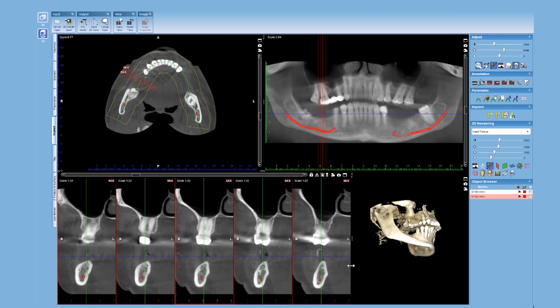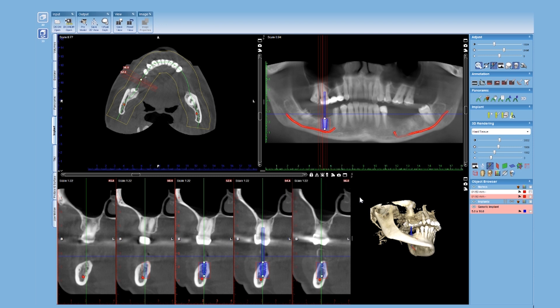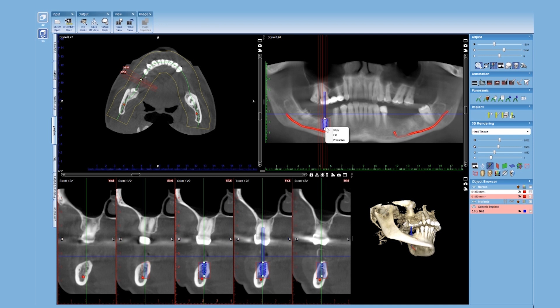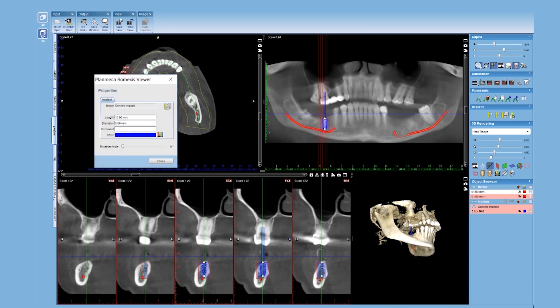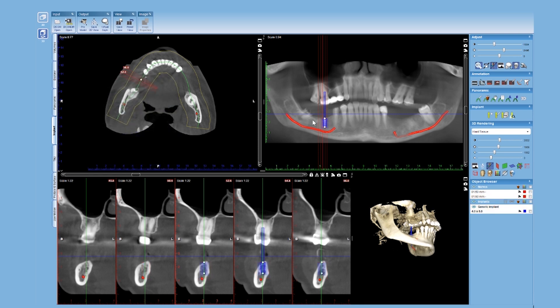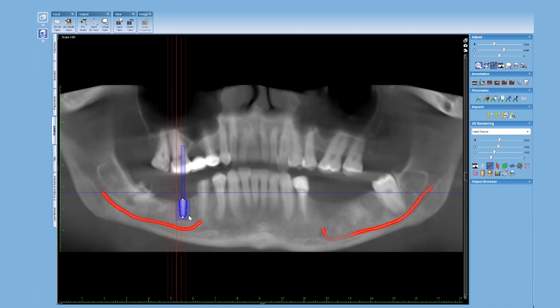Whenever we have a compromised case like the one we saw on the chair, we need to really plan our implants properly. Using this software, we drop an implant and it tells us it is impinging on the inferior alveolar nerve. So we can virtually resize the implant — bringing it down from 5 mm to 4 mm diameter and 8 mm length — and now it seems to be sitting clear of the inferior alveolar nerve. Let's see this on the large screen.